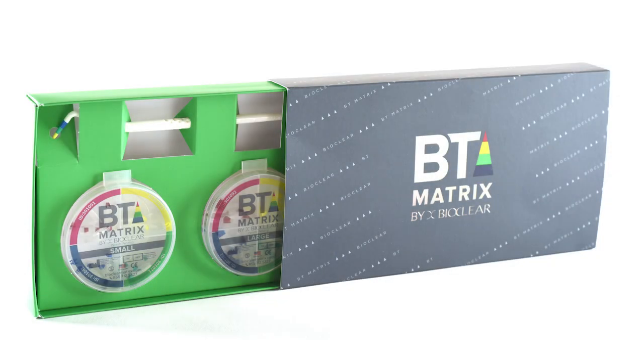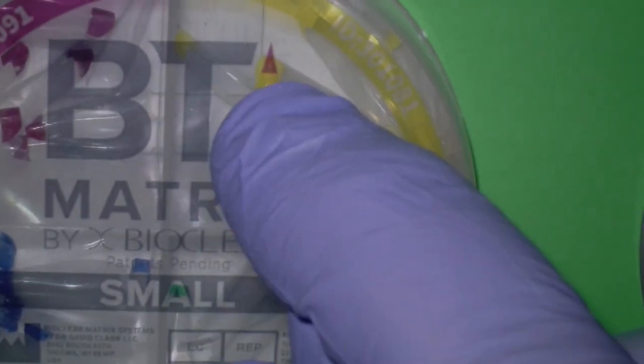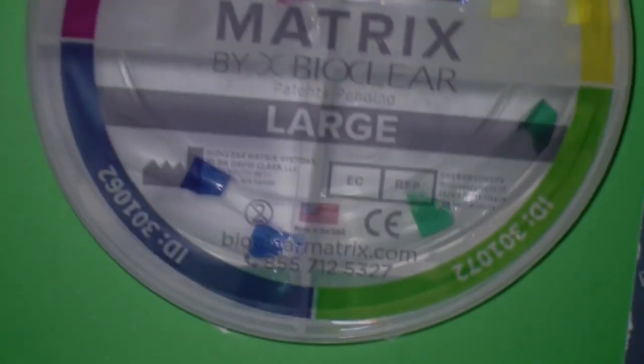Let's go ahead and try in our matrices. I'm going to be using matrices from the BT kit. We'll open up the kit now. I'll be using a matrix from the small kit. I've selected yellow for the mesial. That corresponds to a certain emergence profile.